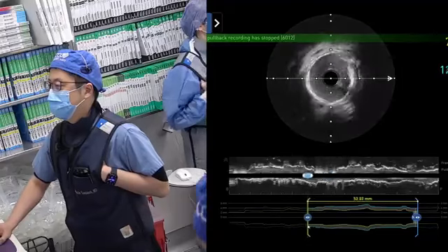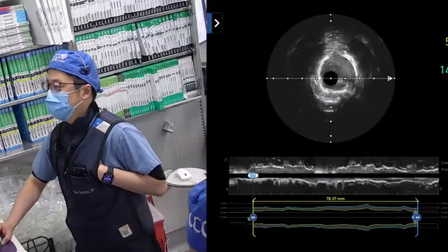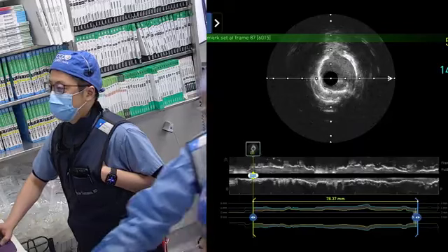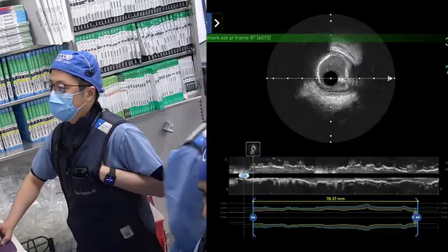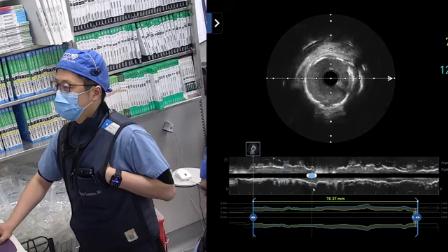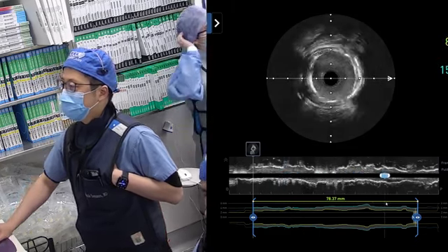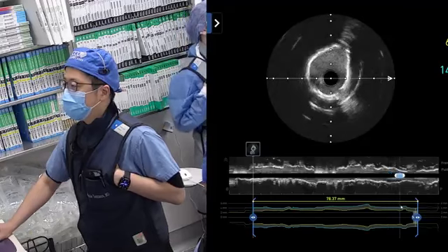Artery knows who's doing the PCI. So this is at the distal edge. The area is like... No, you need 5.8. All right, so I think it looks very good on angiogram as well. Take the wire out, maybe just the last picture with the vasodilator and pacemaker. Look at the area. Still 7. With pacing, you have to wait a little bit.